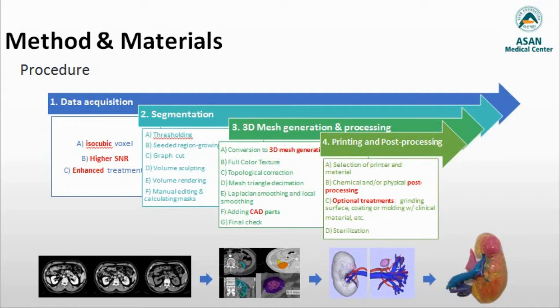For 3D printing in medicine, we primarily need DICOM data for medical use. After patient scanning with CT or MRI, the DICOM data can be exported and processed into stereolithography data files, or other 3D file formats, by using segmentation, surface extraction, and 3D model post-processing.